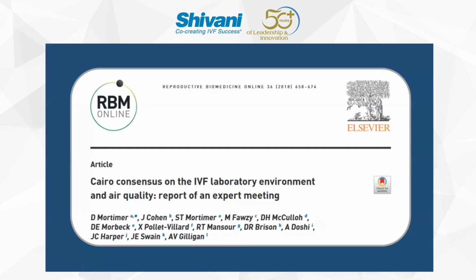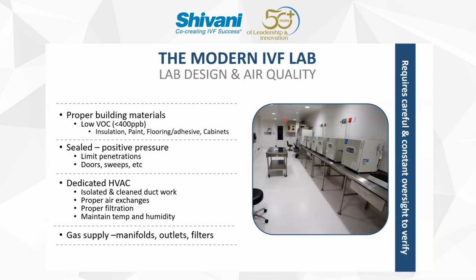I like to highlight existing literature for people to go back and read up further and do a deeper dive than what we can cover here in a 10 or 15-minute talk. This is one of the more recent publications, a really great consensus that's been going on for the last several years out of Cairo with Mohammed Fazi and colleagues and David Mortimer, Jacques Cohen, a who's who of IVF contributing to this particular publication, talking about this very topic, air quality and other topics. I suggest you pull this up and read this if of interest. There are any number of other book chapters out there that also cover this topic in detail.